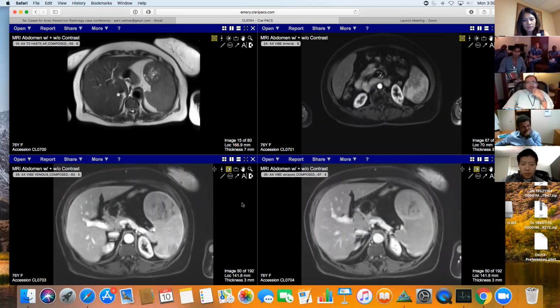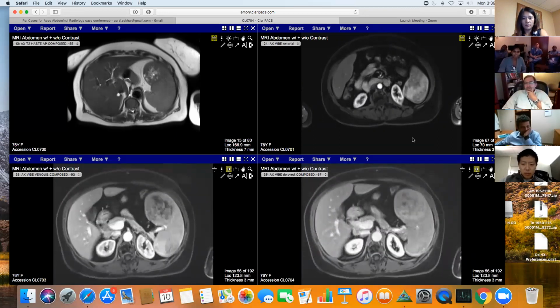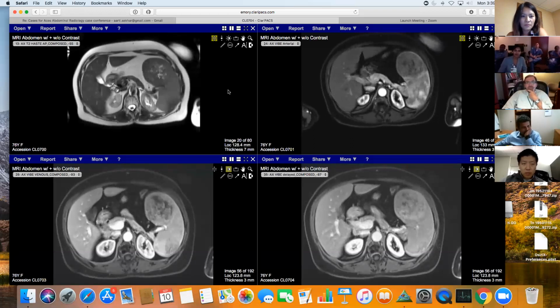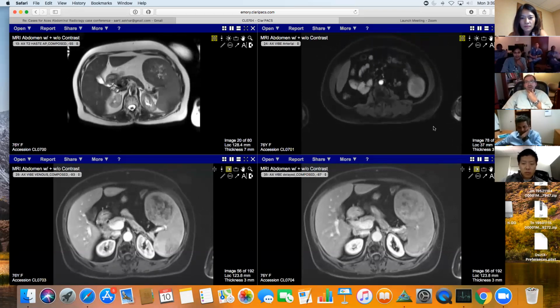Is it new? One of my thoughts was, and I'm looking at images of this, extramedullary hematopoiesis. Yeah, that was definitely within our differential. I just didn't know if it could look so rounded. Yeah, I'm looking at some Google images right now, and some of them are pretty darn rounded.